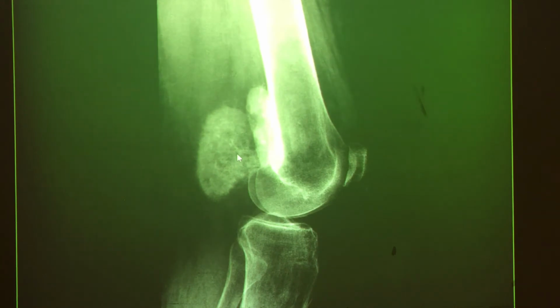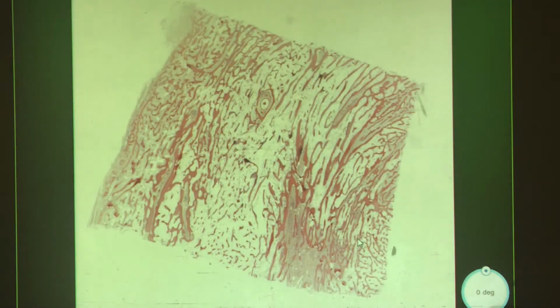Case 9. So here, obviously, is our lesion. Again, I'm not a radiologist, but this is abnormal. And if we go to the case, what we notice is very different from this one is that the slide looks pretty empty. There's not a lot of cells here.